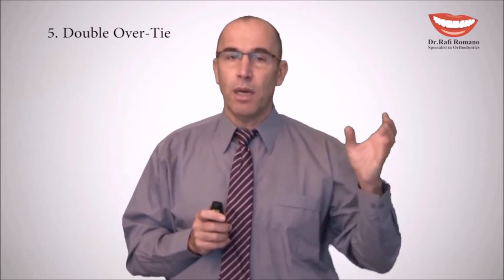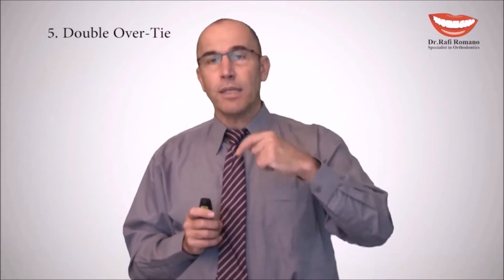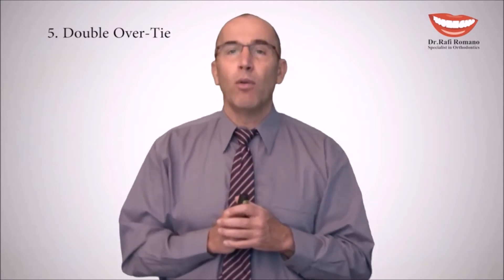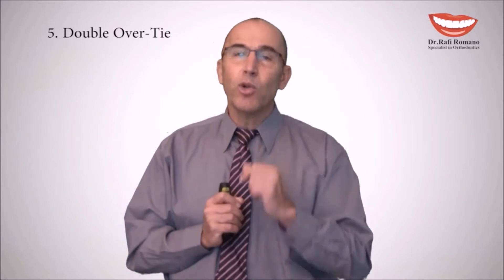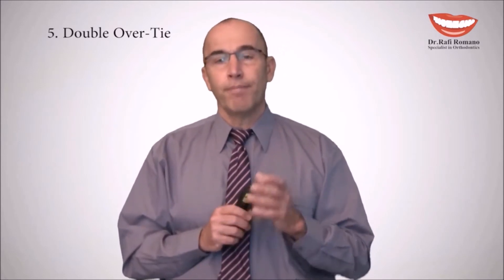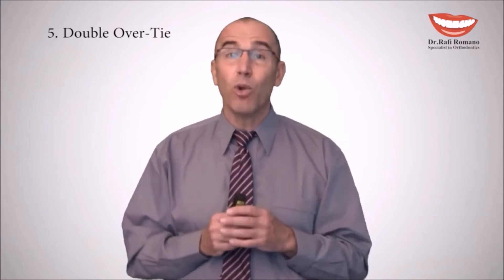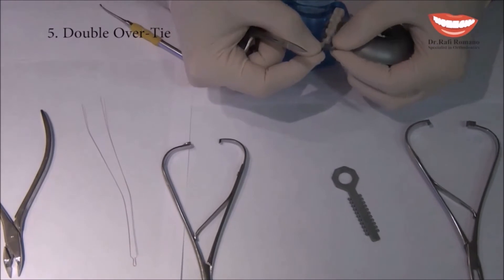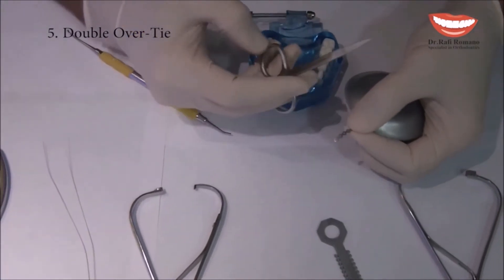This can be done either with an elastic manner using an elastic chain, or with a metal ligature. We will see in a hands-on demonstration both Double Overtie methods, including one called the German Overtie, which was initially presented at a German Lingual Society and is therefore called the German Overtie. Now I will demonstrate one of the most popular ligations in lingual orthodontics: the Double Overtie.